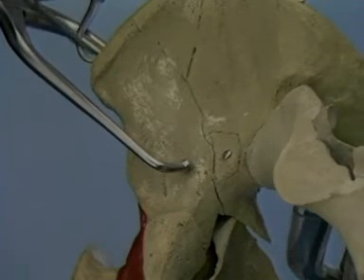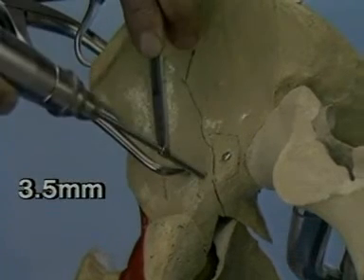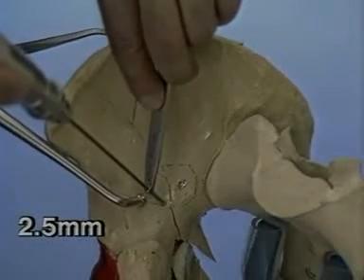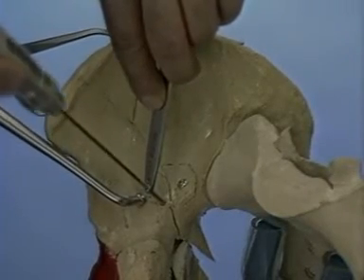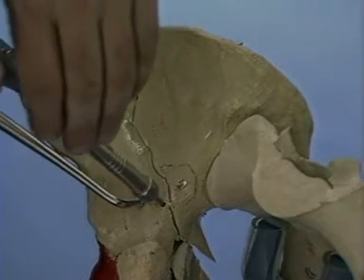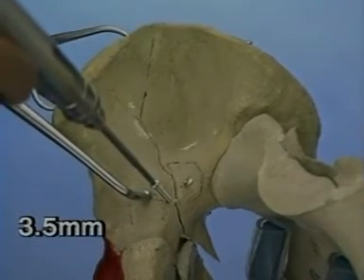Initial fixation of the anterior column is with lag screws. A 3.5 millimeter drill bit is used near the pelvic brim. The threaded hole is drilled with a 2.5 millimeter drill bit. The depth is measured and the 3.5 millimeter lag screw inserted.